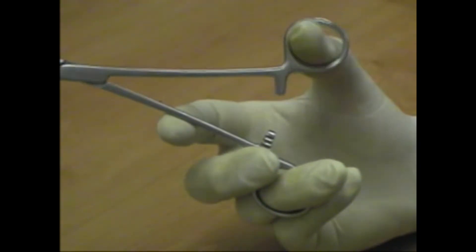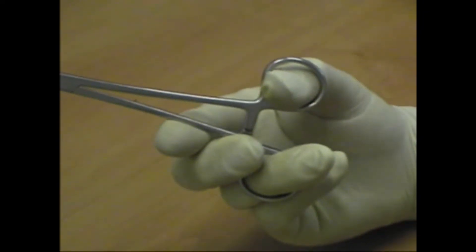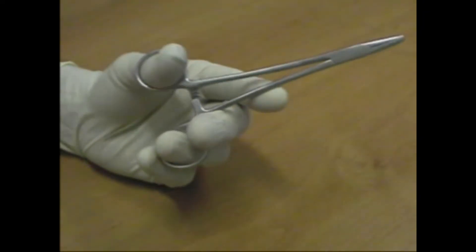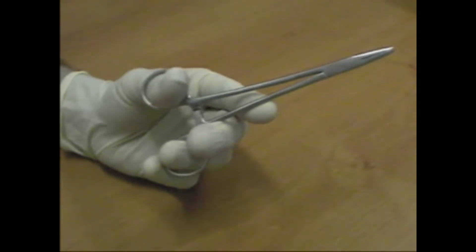Suture holding forceps and artery forceps have a clamping mechanism. Surgeons should master clamping and release of the clamp with both the right and left hand, keeping the tip of the instrument still at all times.